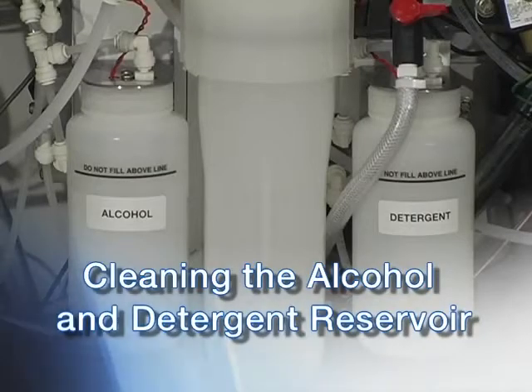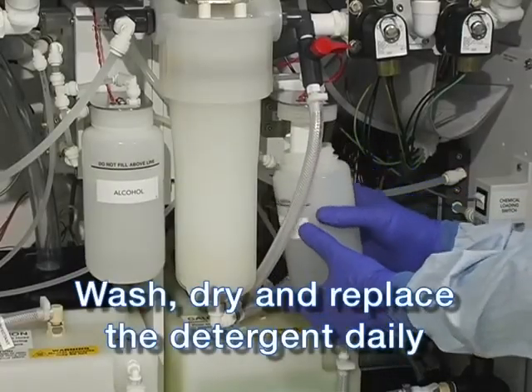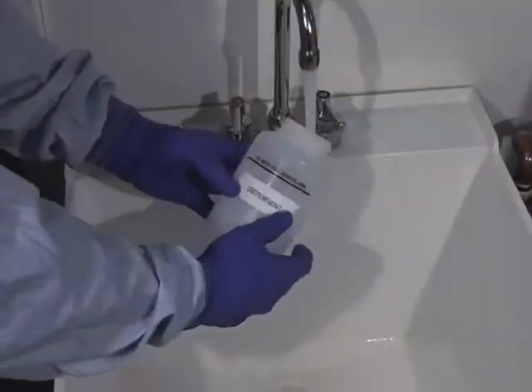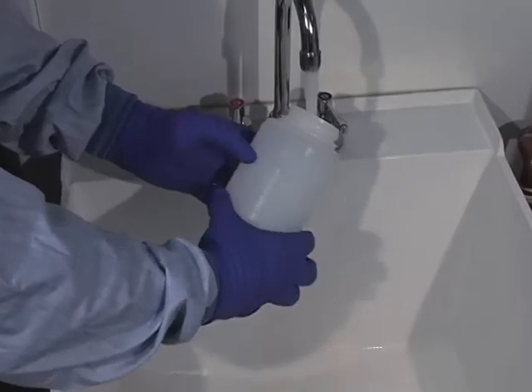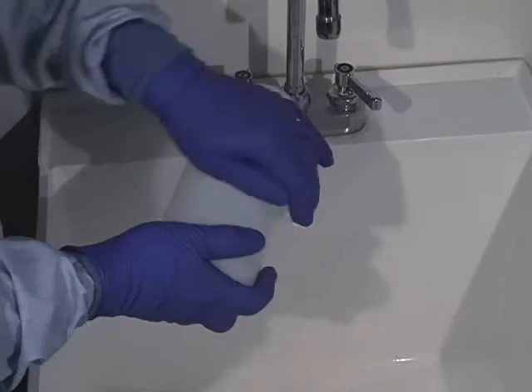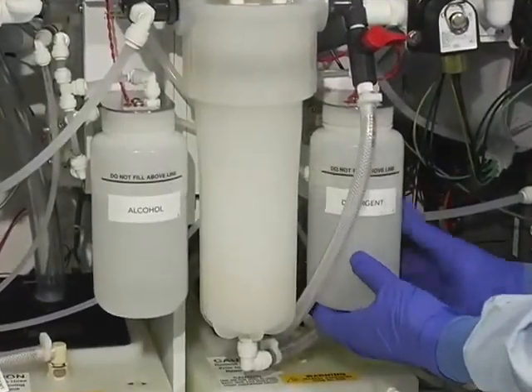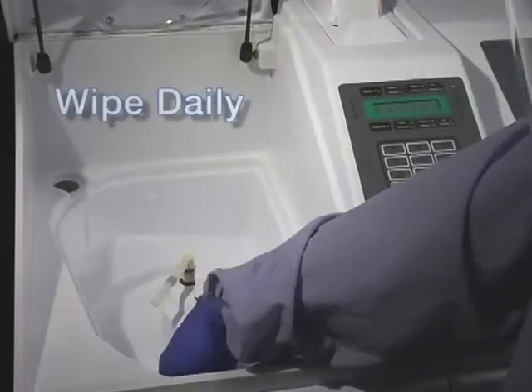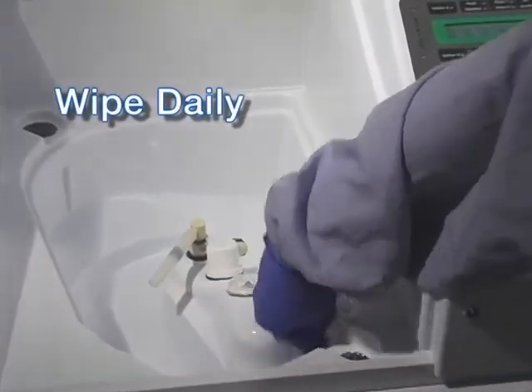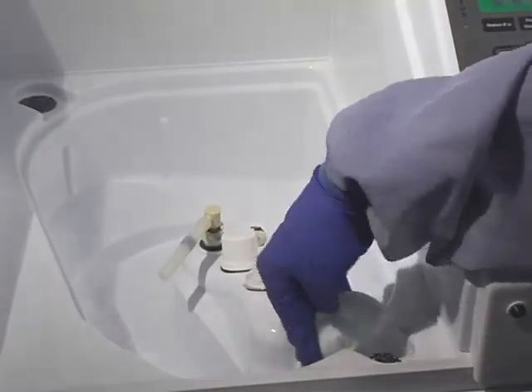The detergent reservoir should be cleaned daily. Detach the reservoir by unscrewing it from the fixed cap. Rinse the reservoir with hot water to remove all detergent residue, then dry it completely. Screw it back onto the fixed cap on the right side of the internal water filter housing. Sanitize the handles of the cover and floating lids along with the exterior of the DSD at the end of each day with a damp, lint-free cloth wetted with an EPA-registered sanitizer.